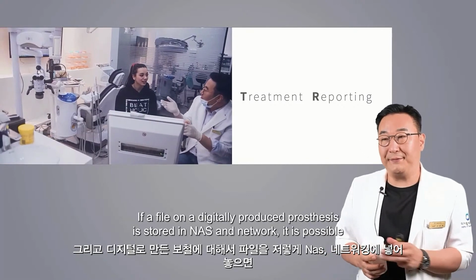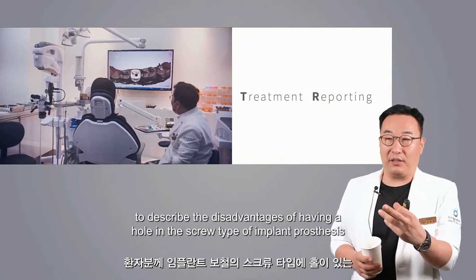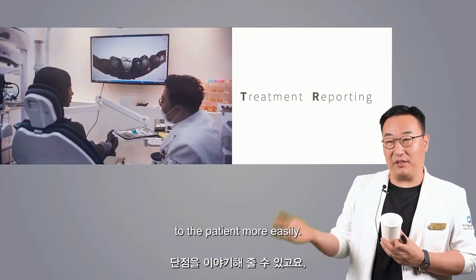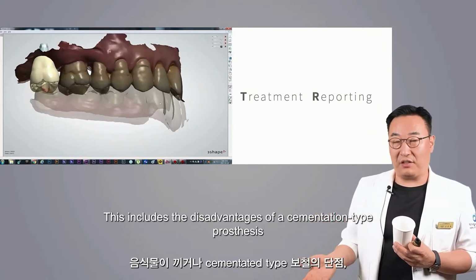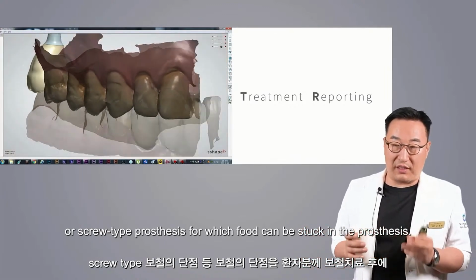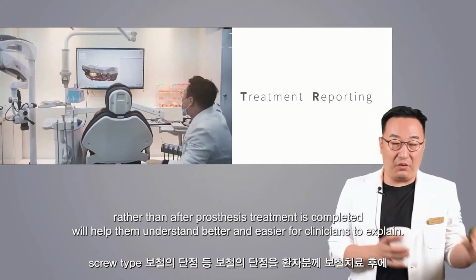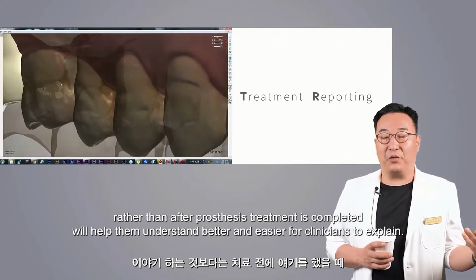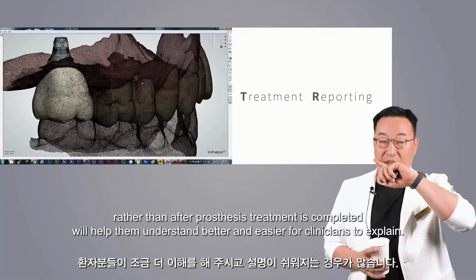If a file on a digitally produced prosthesis is stored in NAS and network, it is possible to describe the disadvantages of having a hole in the screw type of implant prosthesis to the patient more easily. This includes the disadvantages of a cementation-type prosthesis or screw-type prosthesis for which food can be stuck in the prosthesis. Describing such disadvantages to the patients before the treatment, rather than after the prosthesis treatment is completed, will help them understand better and make it easier for clinicians to explain.